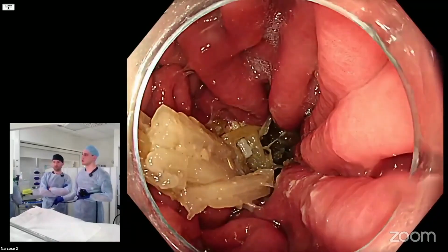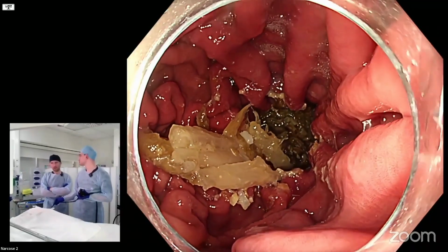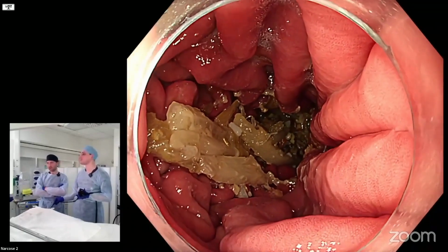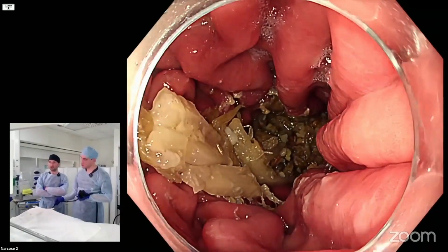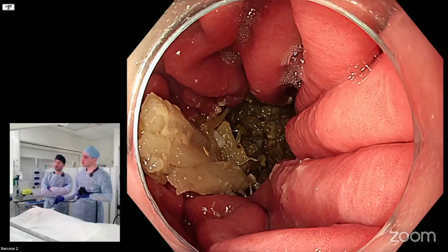Here, right? Okay, so we have a cap on the endoscope. That means that we have to acknowledge that when we're doing our measurements. So let's exclude it, right? The tip of the endoscope is a little bit off where the tip of the cap is. Don't measure where the tip of the cap is. So just come back and show people how you're doing this measurement.